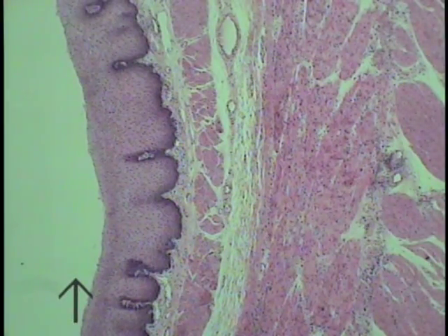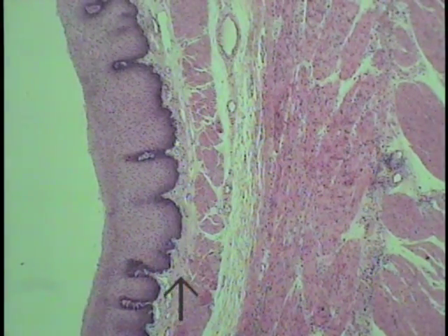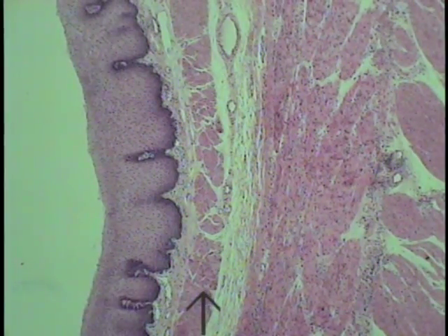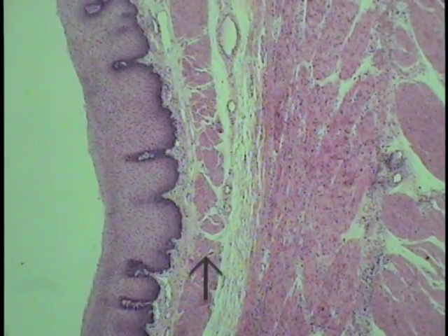This particular field illustrates a longitudinal cut through the esophagus. Note the following strata: the epithelium, a non-keratinized stratified squamous form of epithelium, and in structure and in depth very similar to that which lines the oral cavity. And underlying and supporting is the lamina propria. And finally, a fairly robust smooth muscle band, as indicated by the arrow, which is the muscularis mucosae.